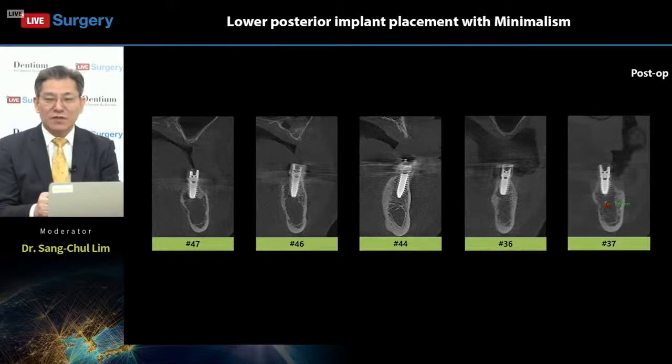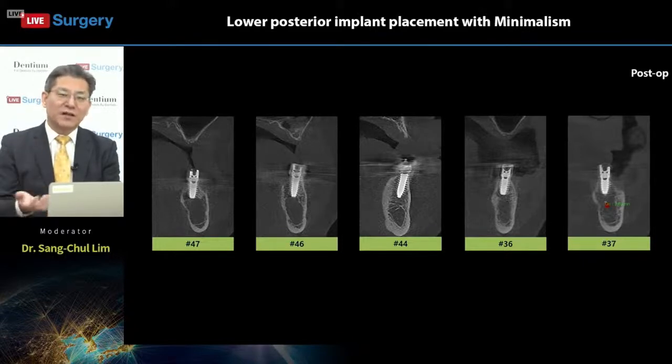So Bright cone beam CT has been upgraded nowadays. Automatically, this nerve detection function was added. This function is operated by AI, so it is accurate, simple, easy, and very comfortable. With just one click, we can clearly see the inferior alveolar nerve running.